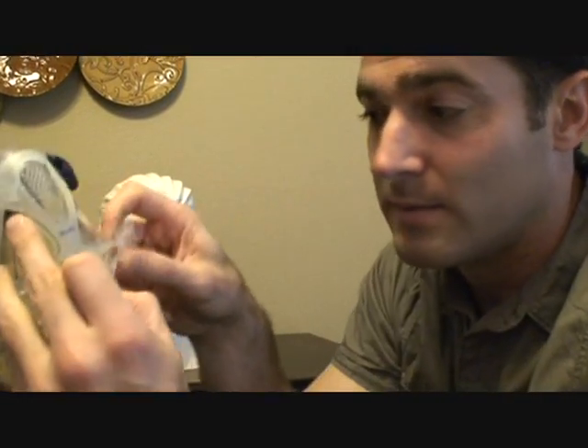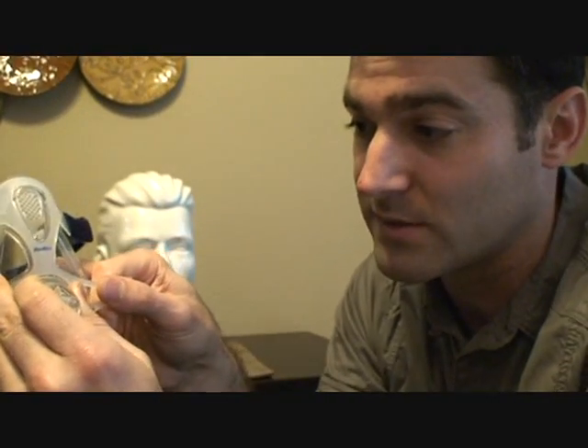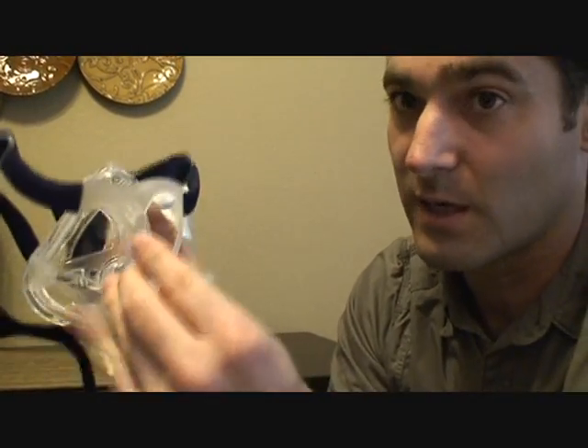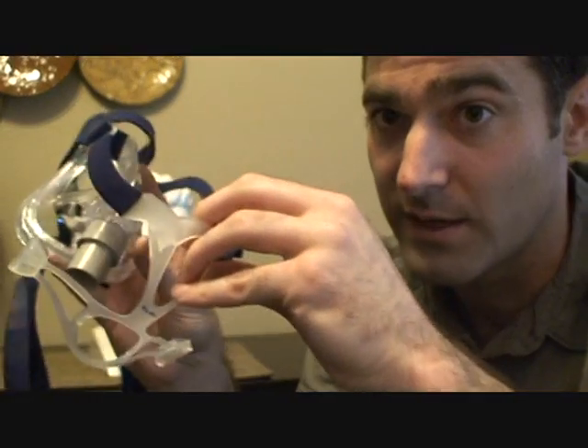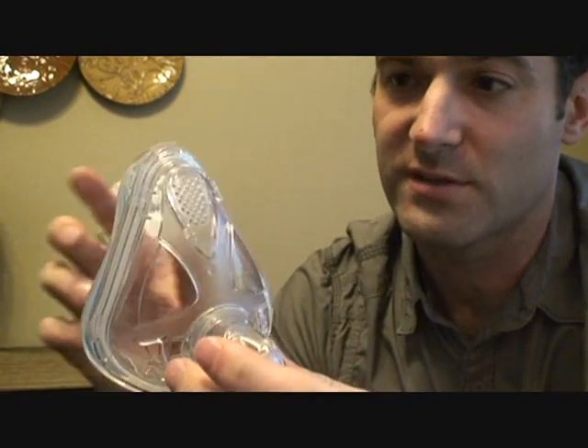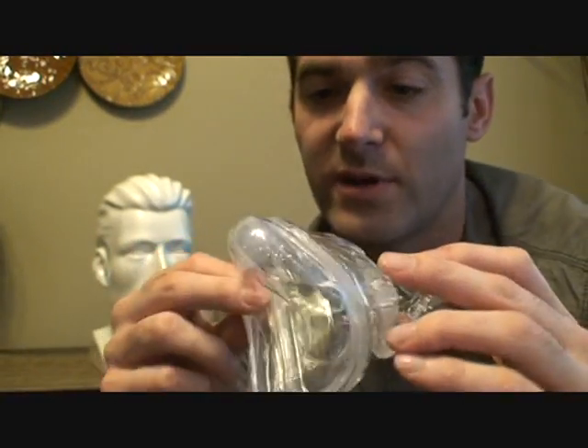Pull it this way to give it a little clearance so you can pull it off. Then the other side comes off, and you just follow it down the nozzle, and you're left with just the actual mask cushion part.